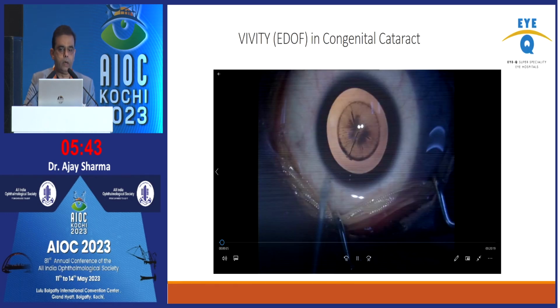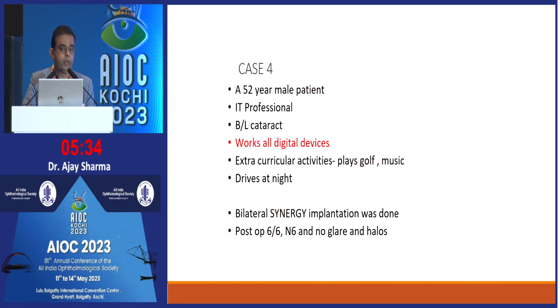I am not going to the videos. This is a congenital cataract which was implanted with Vivity, and the patient is happy. But again, an add of around 1.25 for near was added after 3 months in that young patient.